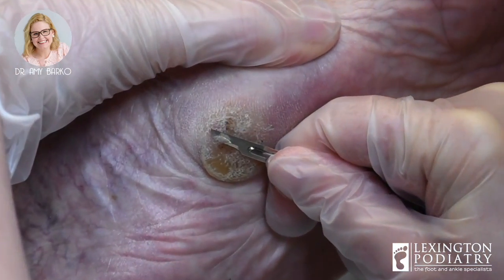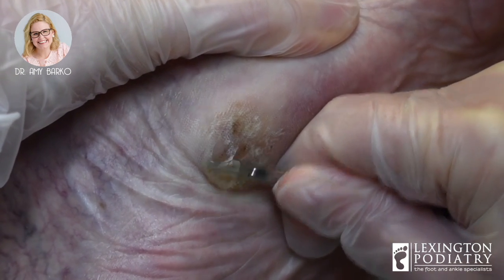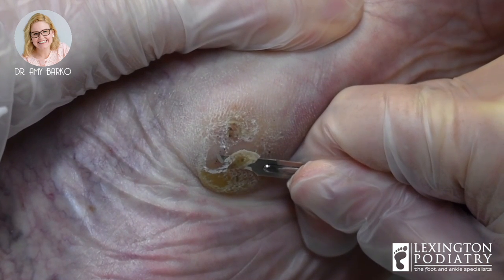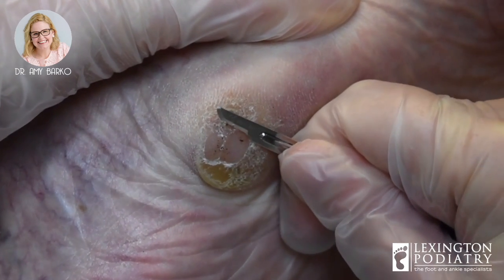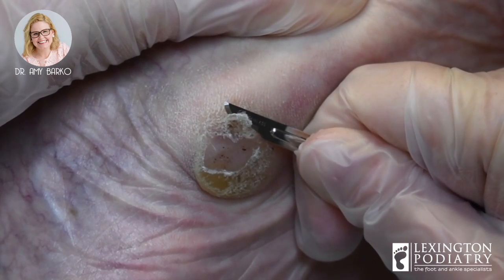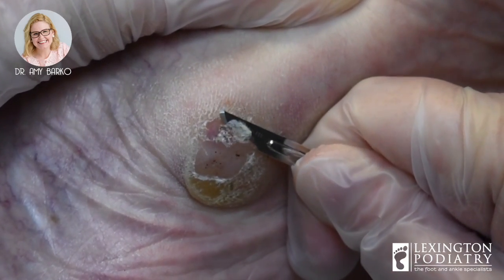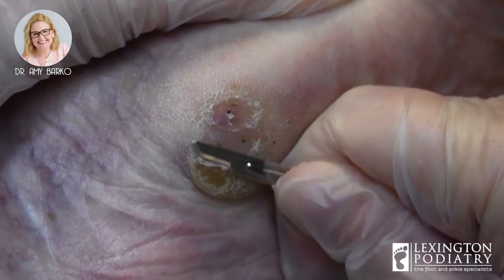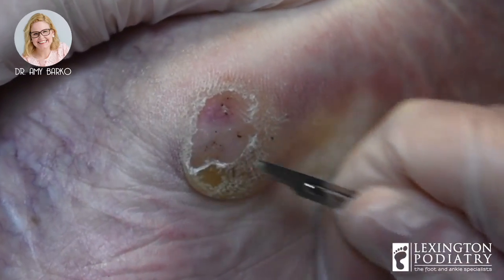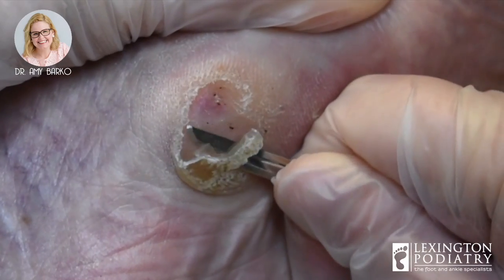So we're going to trim it. Now, sometimes when you trim calluses, you can see the black dots in her callus — that is blood. It's not fresh blood, it's old blood, but it's from so much pressure. Some people, or even some doctors, may say before you come in to soak your feet because it makes it easier. Not for me. I just say come as you are — I want to see what your foot looks like in real life.